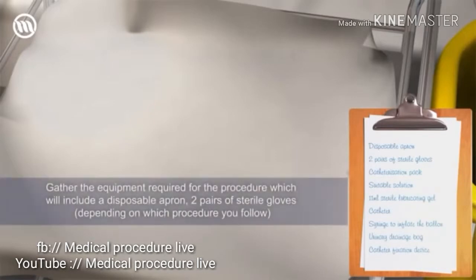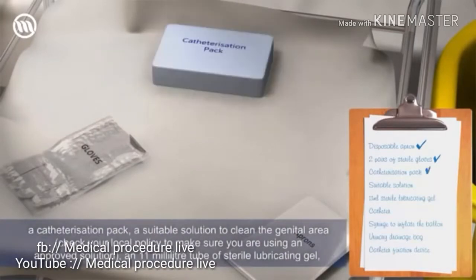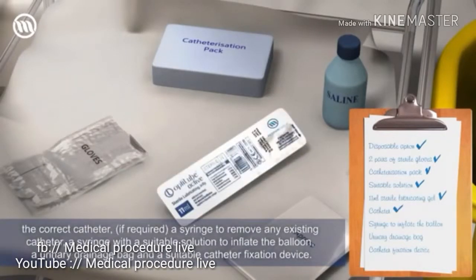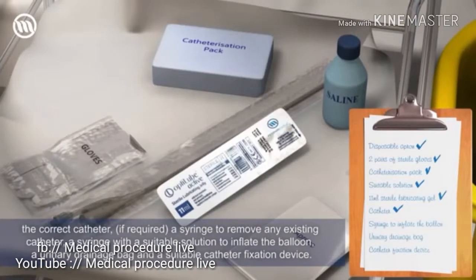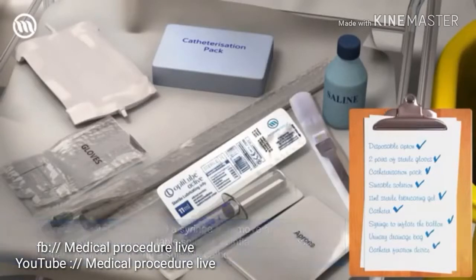Gather the equipment required for the procedure, which will include a disposable apron, 2 pairs of sterile gloves, depending on which procedure you follow, a catheterization pack, a suitable solution to clean the genital area. Check your local policy to make sure you are using an approved solution, an 11mL tube of sterile lubricating gel, the correct catheter, if required, a syringe to remove any existing catheter, a syringe with a suitable solution to inflate the balloon, a urinary drainage bag, and a suitable catheter fixation device.